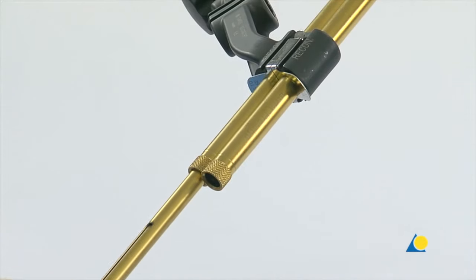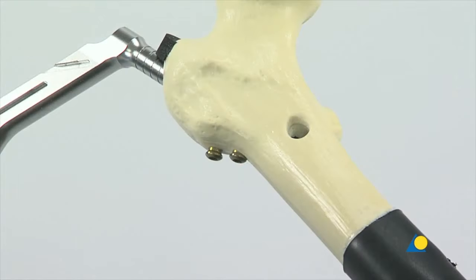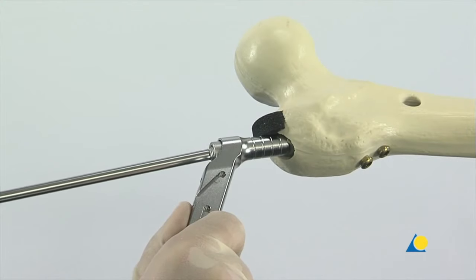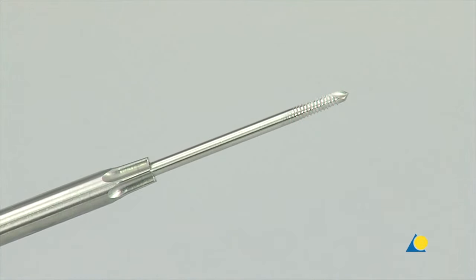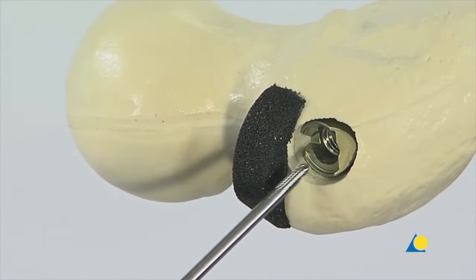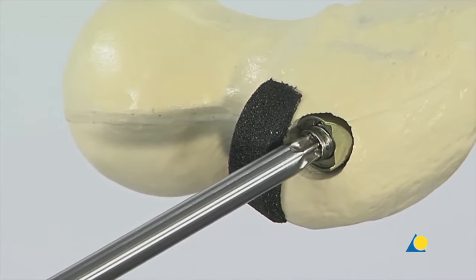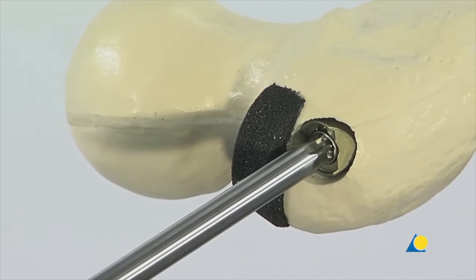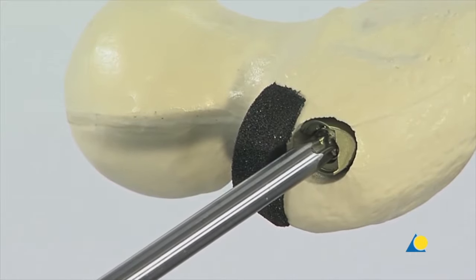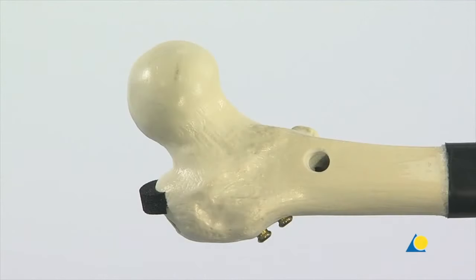The same procedure is followed for the cranial screw; this time a 105mm long hip screw is used. The protection sleeves are removed. The connecting screw is loosened and the insertion handle and the aiming arm are removed. To insert an end cap, the T40 screwdriver and a guide wire are used. The guide wire assists in centering the end cap in the nail. The end cap is slid over the wire and onto the screwdriver. To minimise the chance of cross threading, the end cap is turned anti-clockwise until the thread of the end cap aligns with that of the nail, then turned clockwise to thread it into the nail. The screwdriver and the guide wire are removed.